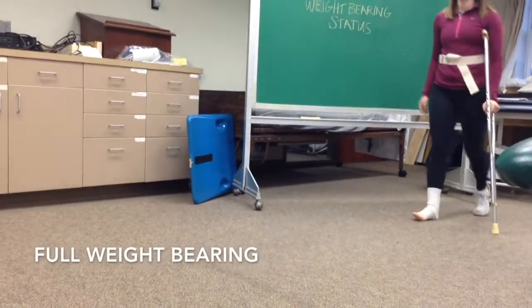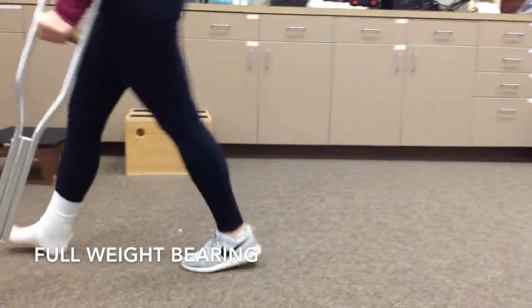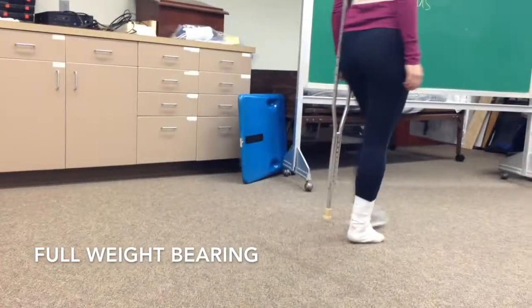In full weight bearing, a patient is allowed to bear full weight over the involved lower extremity. The assistive device should not be used to alleviate weight, but can be used as a balance assistive device.